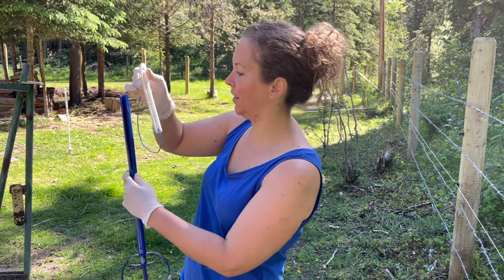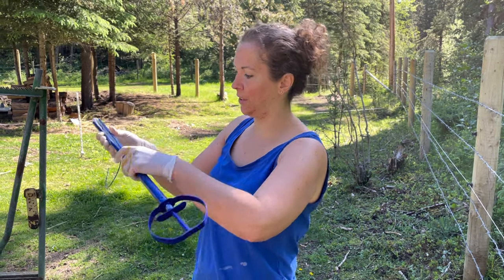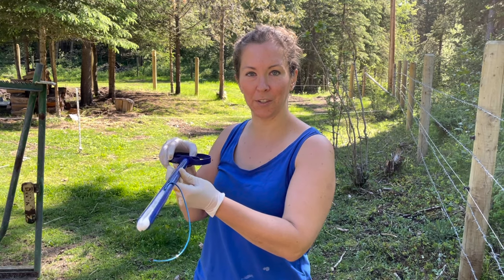So you want to slide your CIDR device in like so, with the tail curving down, and we're gonna put some lube on this and we'll be ready to insert it.